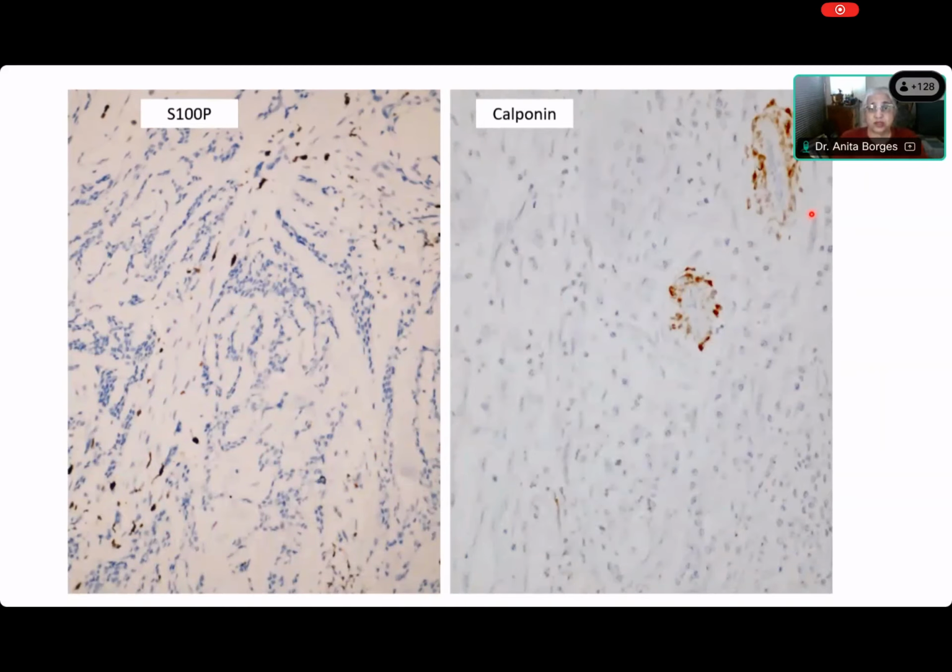There's no S100 protein, which is also a marker of myoepithelial cells, and there is no calponin. Okay, what is calponin being expressed in, Somik? You see some brown stuff? Yeah. So what is it being expressed in? Can you think what this calponin is being expressed in? Okay, Akshana, will you help him? These can be blood vessels. They are blood vessels. This is the smooth muscle of the blood vessels. So calponin is one of the markers that we use to determine whether or not there is smooth muscle in a variety of different conditions. And here you have calponin. So, the stain has worked because the internal control is there and the cells are negative.